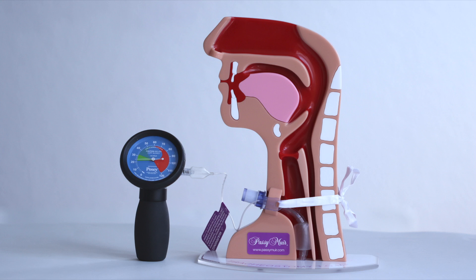Palpation of the pilot balloon is not an appropriate way to assess cuff pressure. The proper way to measure cuff pressure is by using a cuff manometer designed for that purpose, and should be performed regularly and whenever air is added to or taken out of the cuff.